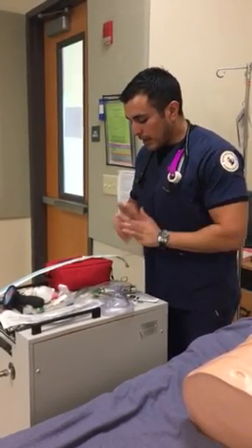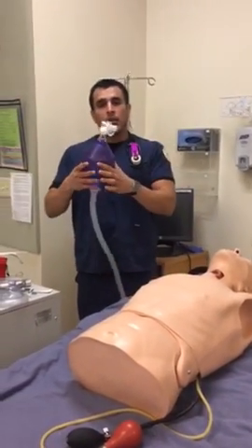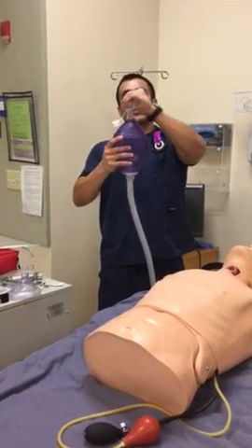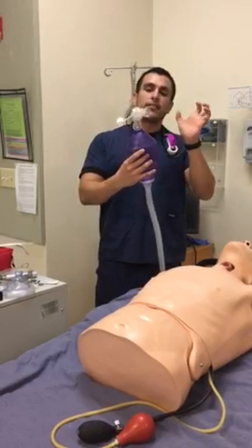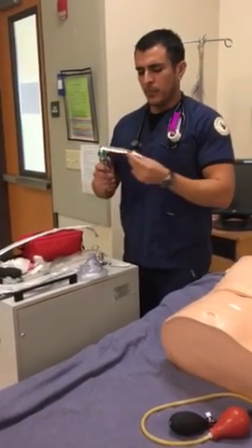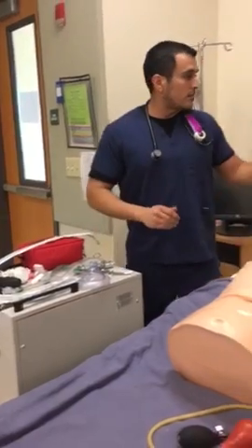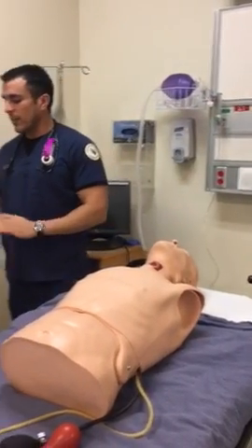Next we would also want to check our devices. We have our bag. We would do our check with the bag, so we're going to make sure that it can self-inflate. We're going to make sure that there are no leaks. And we're going to check the valves, so you can see the valves opening if it checks out. After that, we're going to check the light source. So the light source works. We would check our suction. Our suction pressure, we would want it 100 to 120.